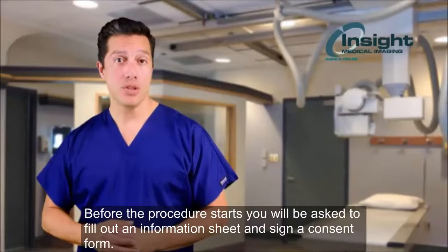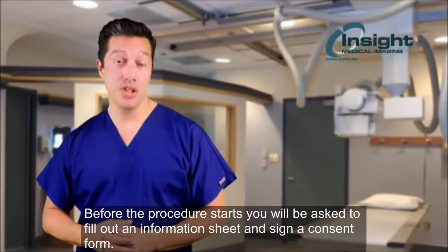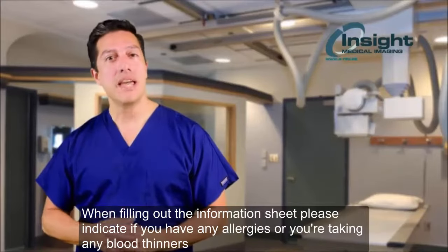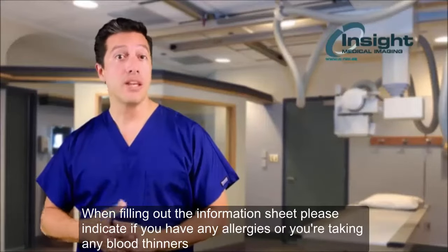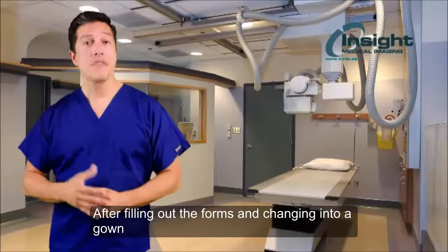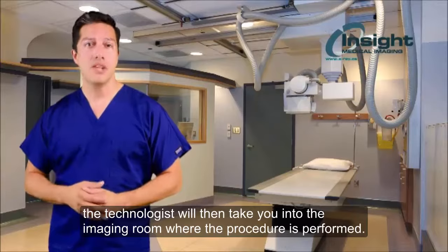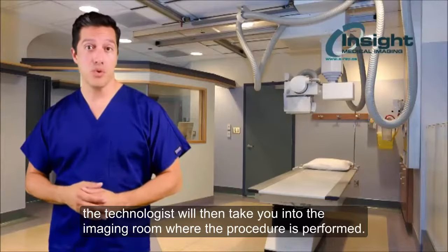Before the procedure starts, you will be asked to fill out an information sheet and sign a consent form. When filling out the information sheet, please indicate if you have any allergies or you're taking any blood thinners. After filling out the forms and changing into a gown, the technologist will then take you into the imaging room where the procedure is performed.